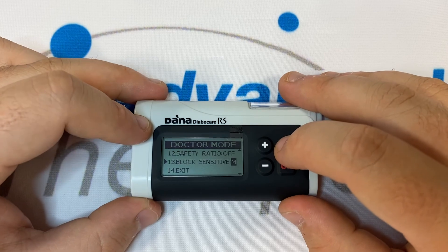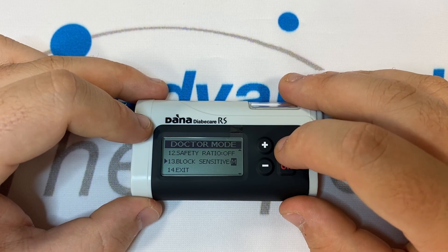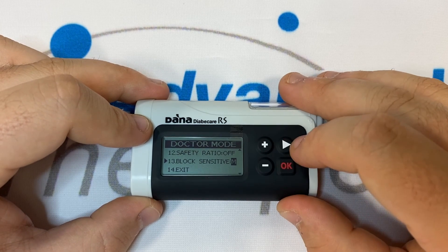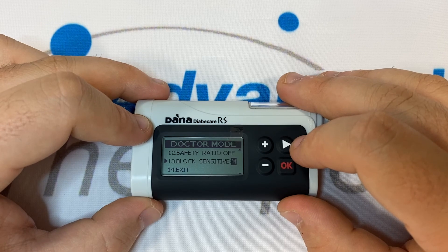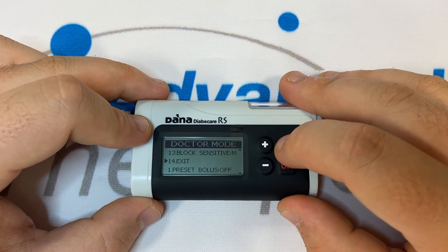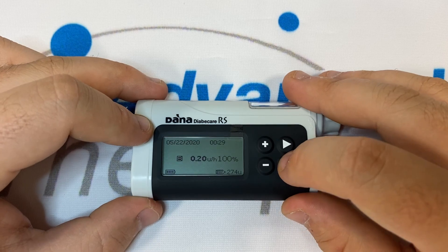Number thirteen is Block Sensitivity — this is your occlusion alarm sensitivity. We have High, Low, or Medium as settings. If you deliver between 0.1 and 3 units an hour, we recommend leaving this at Medium. Number fourteen is Exit — press OK and OK again to save your settings.